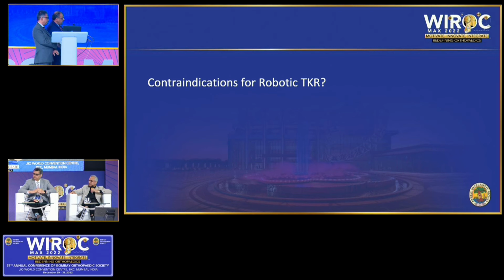Fair number of our practice is rheumatoids. So they are quite significantly osteopenic, osteoporotic. Not that's bad on the rheumatoids one, but a standard rheumatoid can be done. But extremely porotic, the pin can walk in. Then I'm sure you should be a bit careful. I'm not saying you can't do it, bit careful.